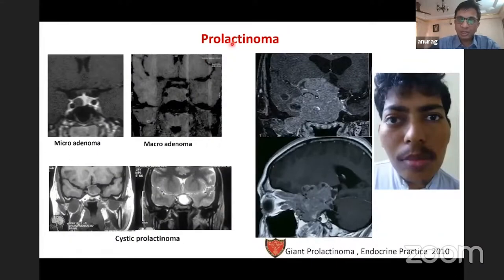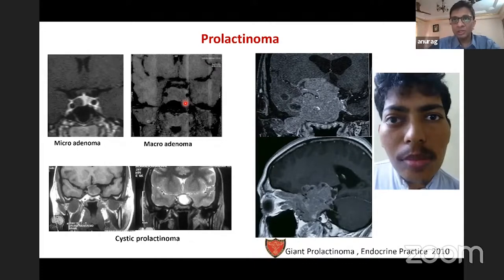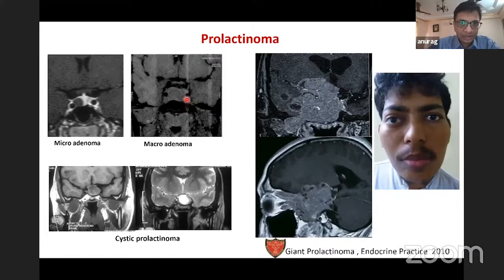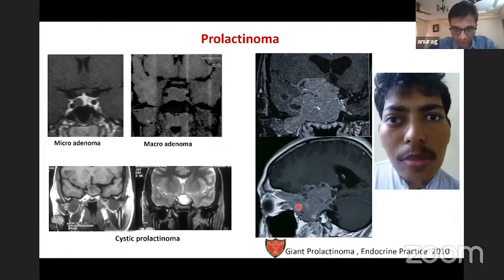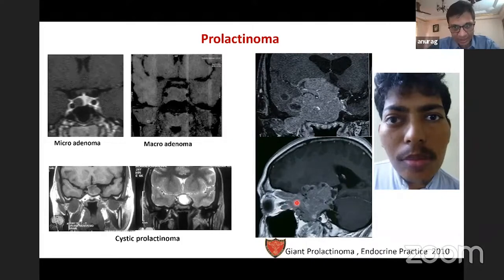For prolactinoma microadenomas, they are T2 hyperintense, but localizing a microadenoma is not critical as treatment is usually directed toward drug therapy. For macroadenomas, MRI is important. At times they can be cystic — dark on T1 and bright on T2. Giant prolactinomas, as in this male with MEN1 syndrome where the tumor extended into the orbit causing proptosis, are more common in males but can occur in females and can extend in all directions.